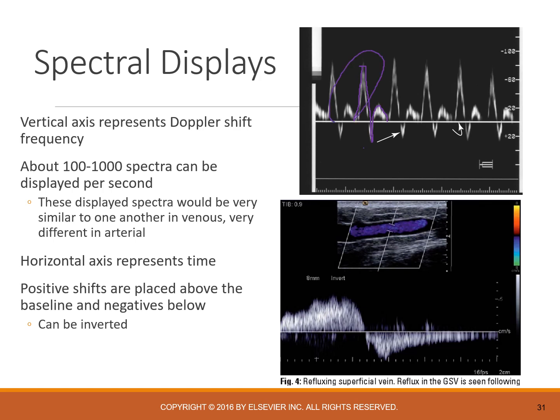1, 2, 3. So phase 1 tells me that I have good pressure behind me. Phase 2 tells me that I have significant resistance in front of me. But phase 3 tells me that my vessels are compliant and able to have that Windkessel effect enough to squeeze that blood flow forward, so it's not so resistant that I can't have any motion.